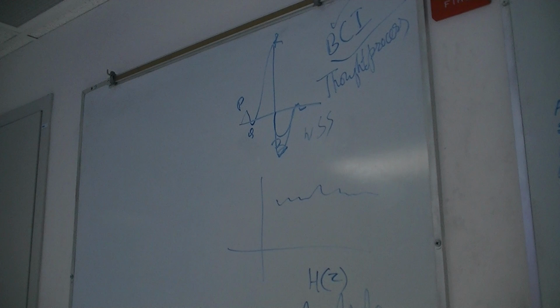So if the doctor says, okay, he has done eye movement, oh, he is thinking something, we want to make that kind of signature so that he can immediately tell by looking at the EEG that here he moved, or he's just sleeping, or dreaming. Means when he sees the signals, he can say, okay, he is doing this. And this is the part where I'm getting that data without noise or other movements.